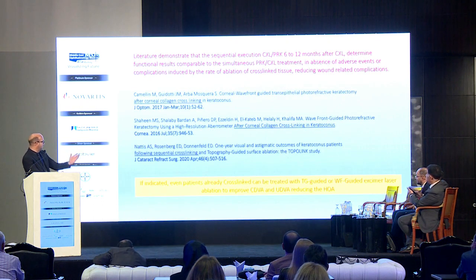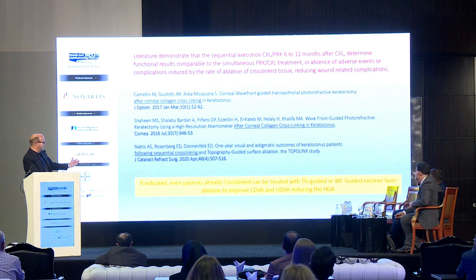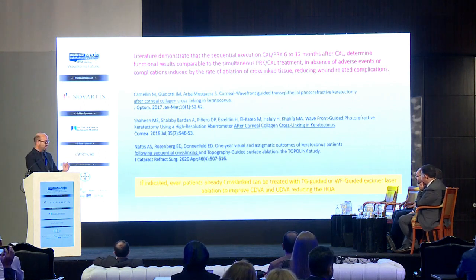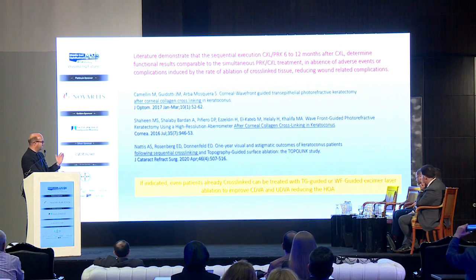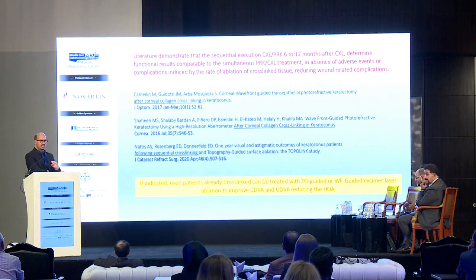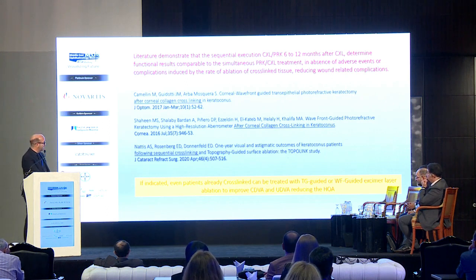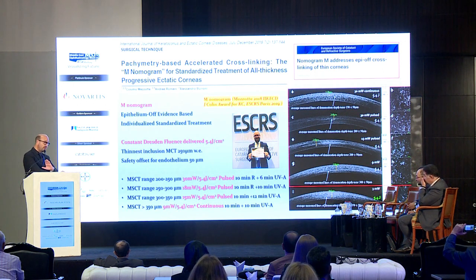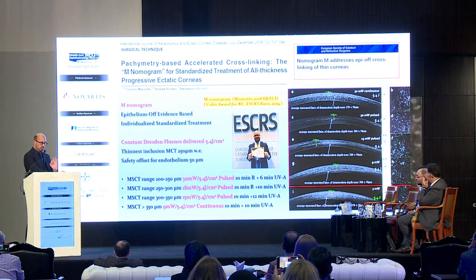To answer your question, if indicated, even patients already cross-linked can be treated with topography-guided or wave-guided excimer laser ablation. So you can do it simultaneously or sequentially. We don't have significant difference in this group of patients. You know that you don't use the Dresden protocol in this treatment. No Dresden protocol. You need accelerated protocols, pulsed light protocols to avoid and minimize haze.